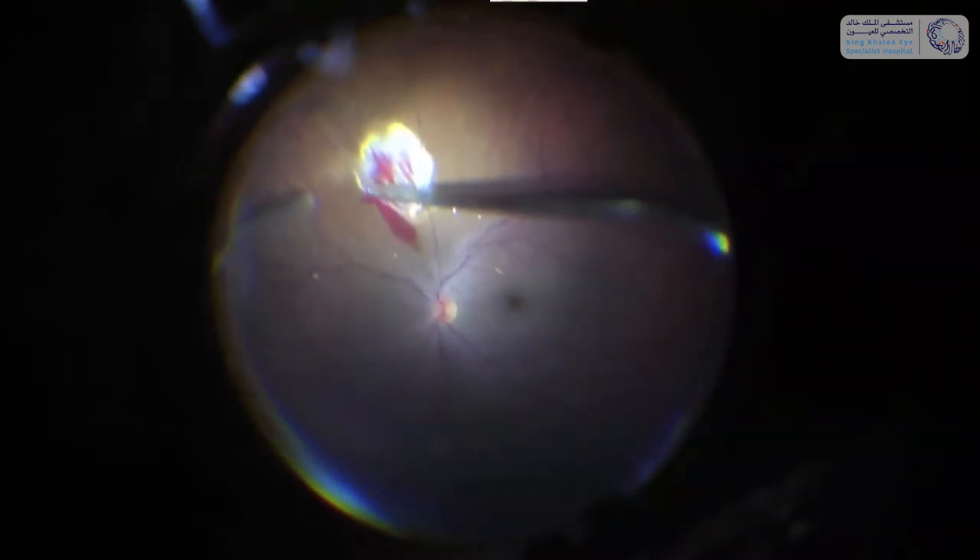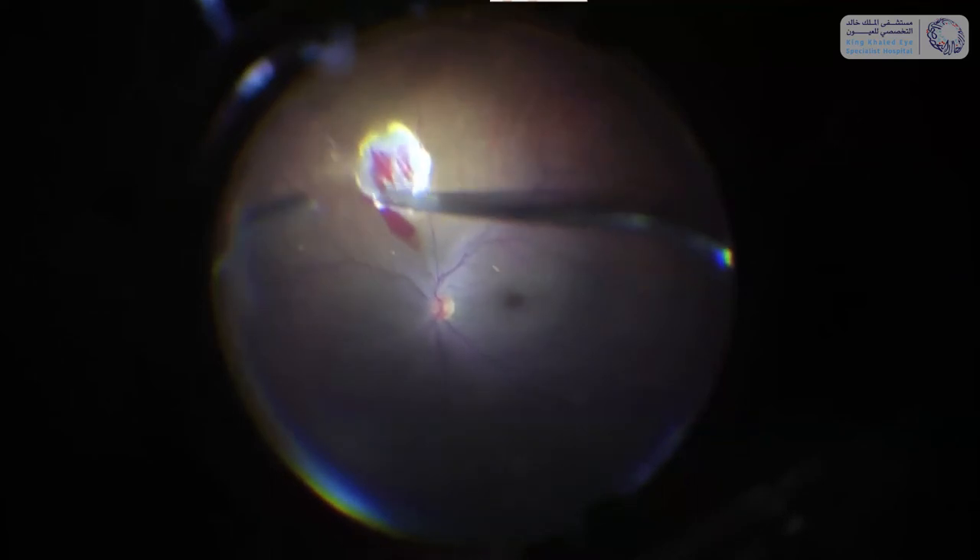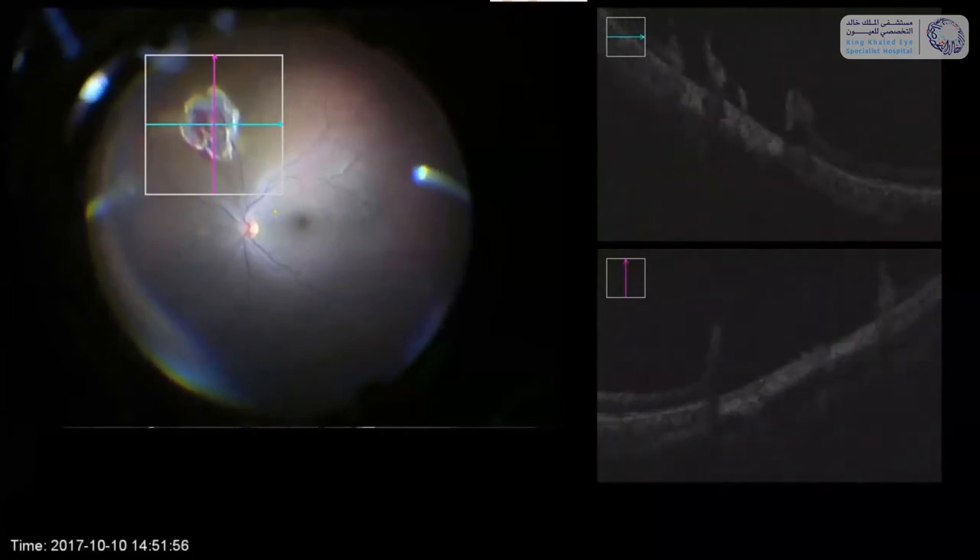This is an instrument which is non-ophthalmic but it works great in these cases. After removal of the foreign body I'm coagulating further the bed where the intraocular foreign body had been sitting — this is again the intraoperative OCT. I added some laser around the area of extraction and filled the eye with air at the end, and it turned out that the result was quite favorable.